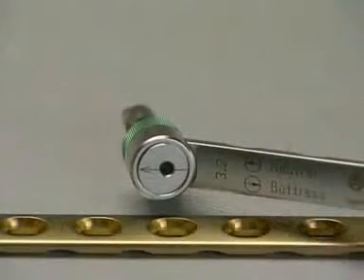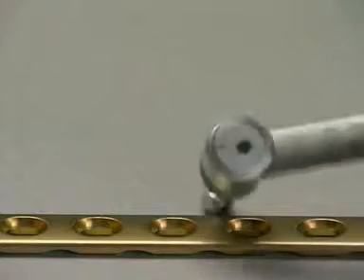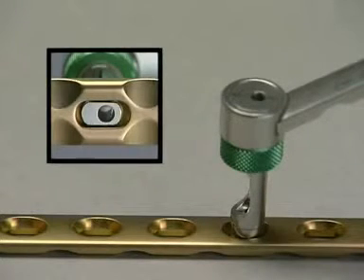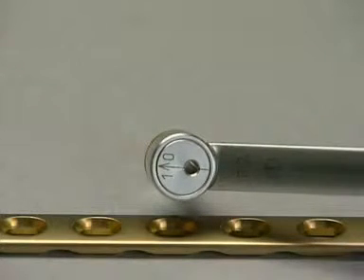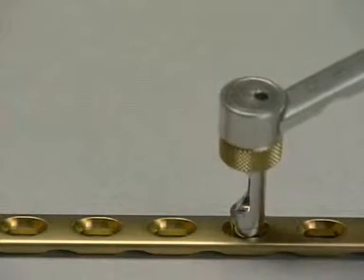The green end of the LCDCP drill guide with the arrow pointing towards the fracture will provide a neutral screw hole. The yellow end of the LCDCP drill guide, also with the arrow pointing towards the fracture, will provide an eccentric screw hole.